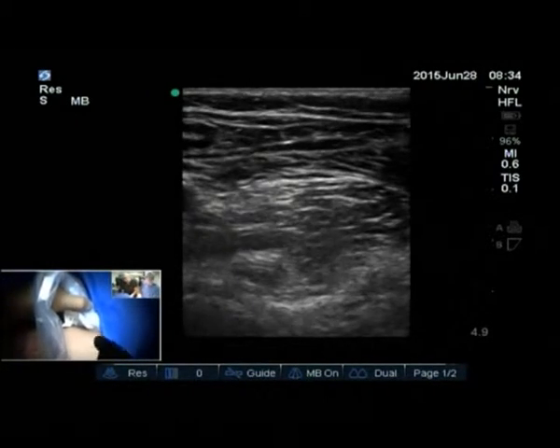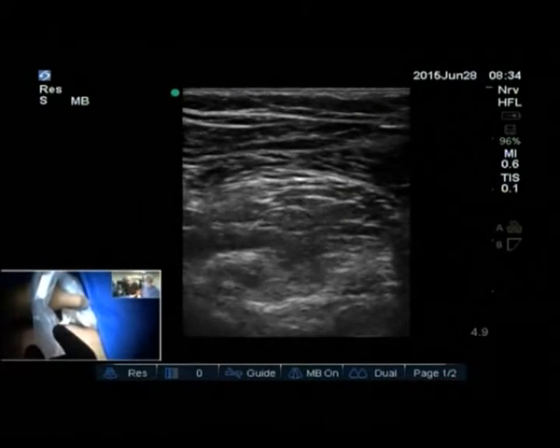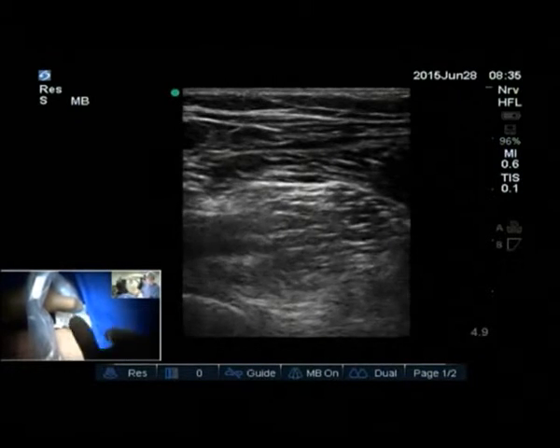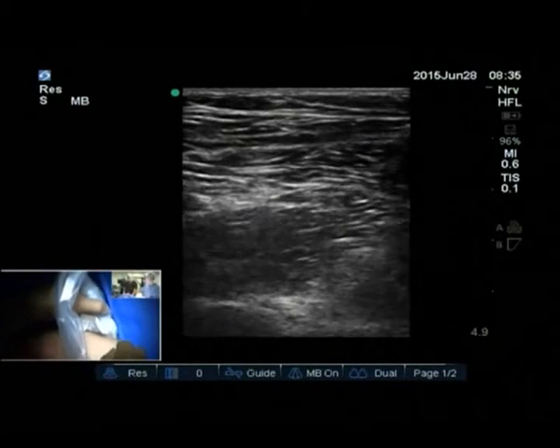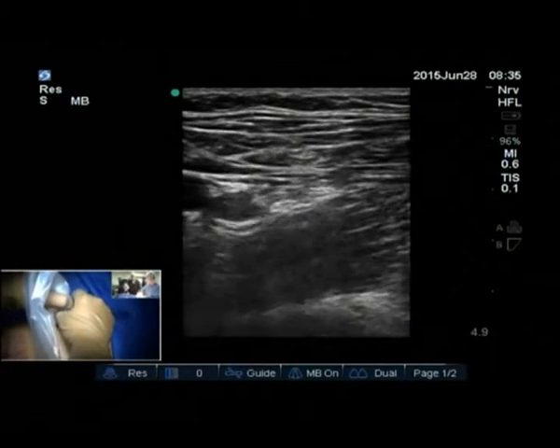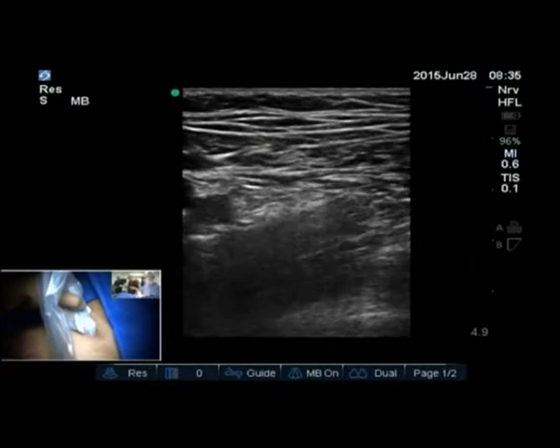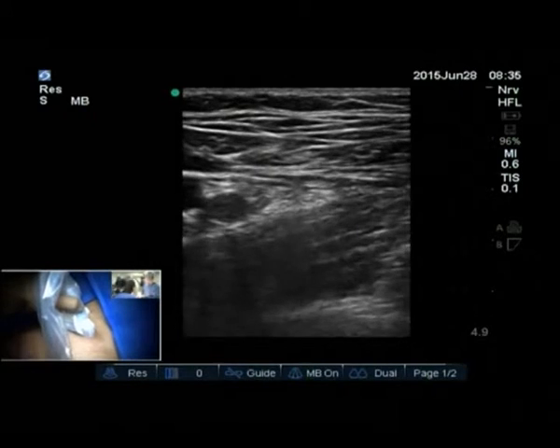And sometimes you will find that the femoral nerve is very lateral. Look above the iliopsoas muscle and look on top for that nerve. Usually it's not a round structure, but it is either oval shaped or like a number of branches lying on top of the iliopsoas muscle. So what you see here, very bright, very nice, is already divided and has more than one branch. You can see that there are at least two distinct hyperechoic structures on top.